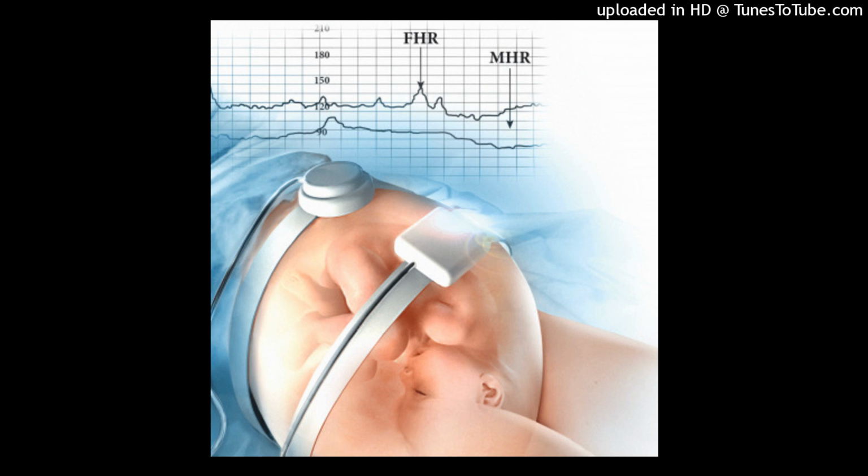The FHR is auscultated at selected intervals based on the woman's risk status and institutional guidelines. Audible increases or decreases may be detected once a baseline rate has been established. During episodes or audible changes, counting in consecutive 6-second intervals and multiplying the rate by 10 should give the clinician an estimate in the beats per minute, BPM, during increases or decreases.